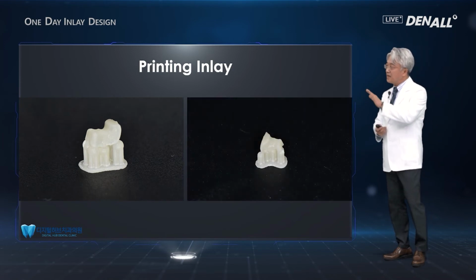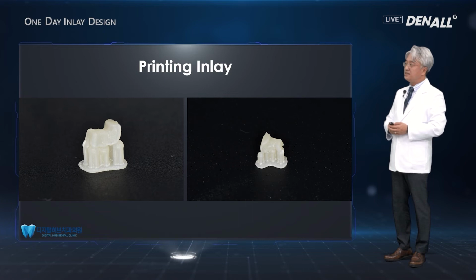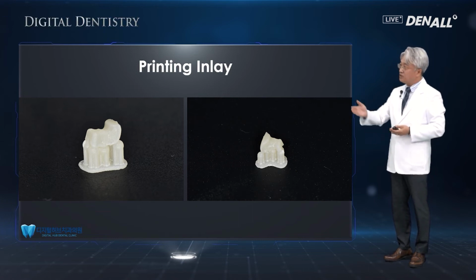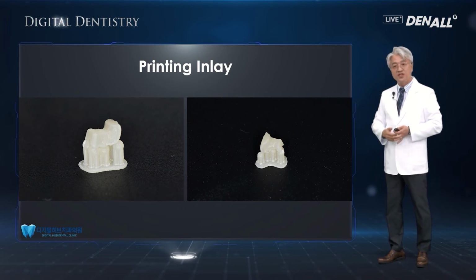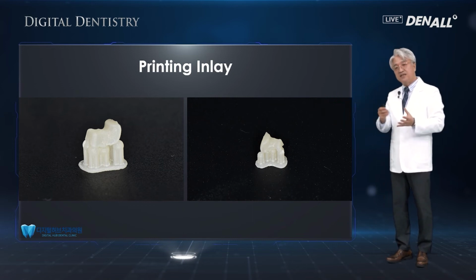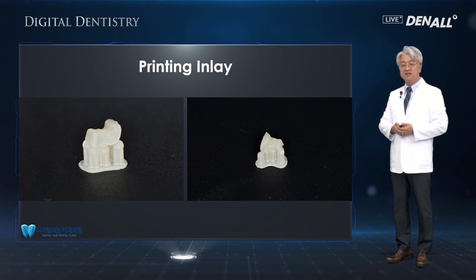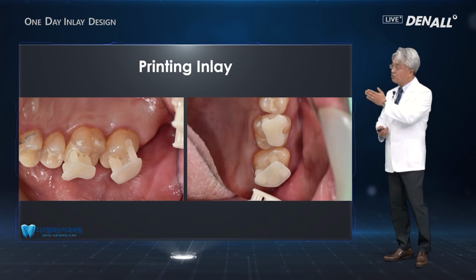Now, the 3D printed inlay, after all the processing is done, just before we deliver to the mouth. And as you can see here, the margin precision is really good, but maybe the fit in the mouth for the patient is currently being improved. So let's look at that.